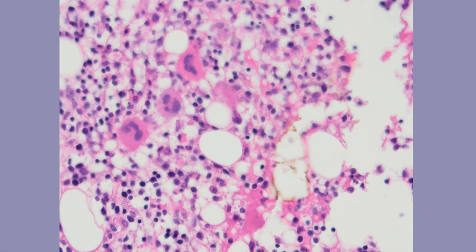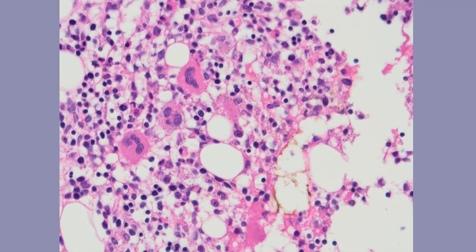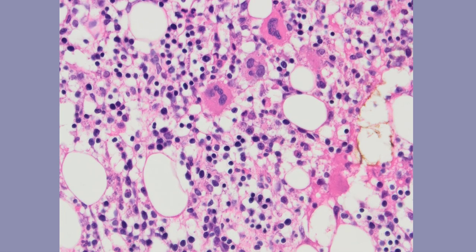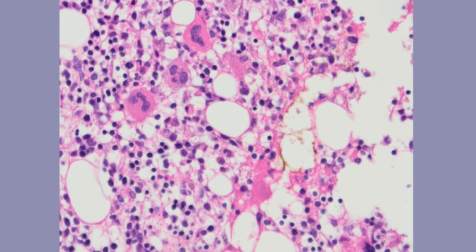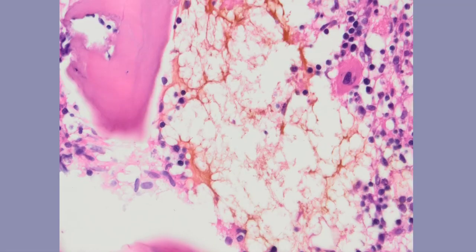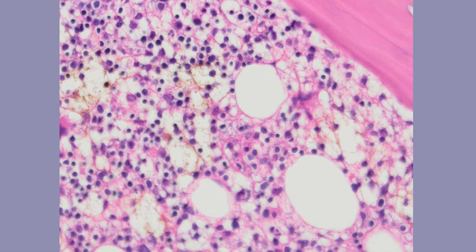And when you zoom in, what draws our attention is that there are these round bodies, most probably intracellular and most probably inside macrophages, as you can see, and they look like they're all kind of similar in size, unlike debris that could be found due to high cell turnover inside the monocytes and macrophages and the histiocytes within the bone marrow. Over here you can see that there are quite a lot.